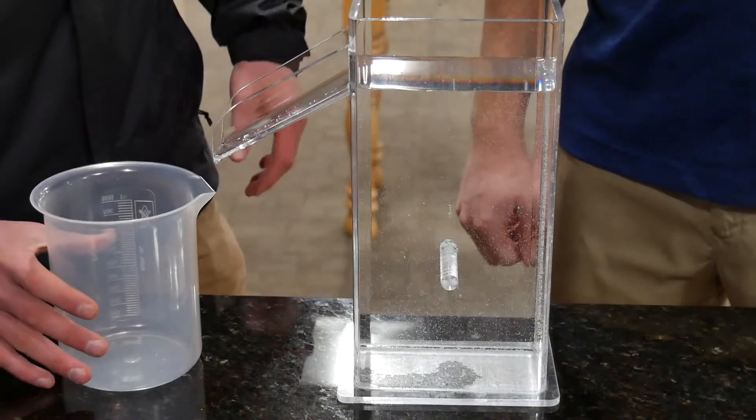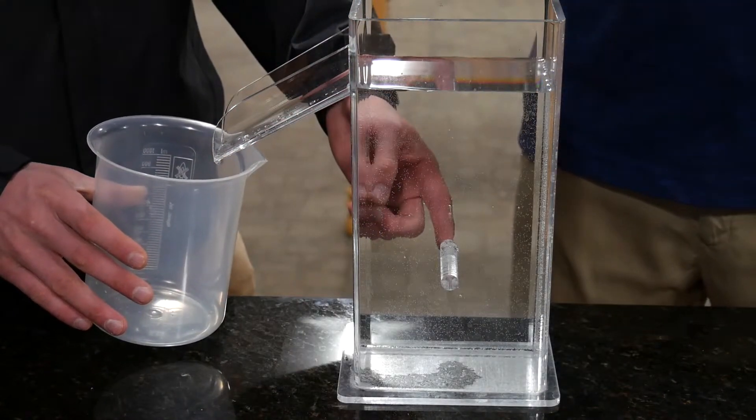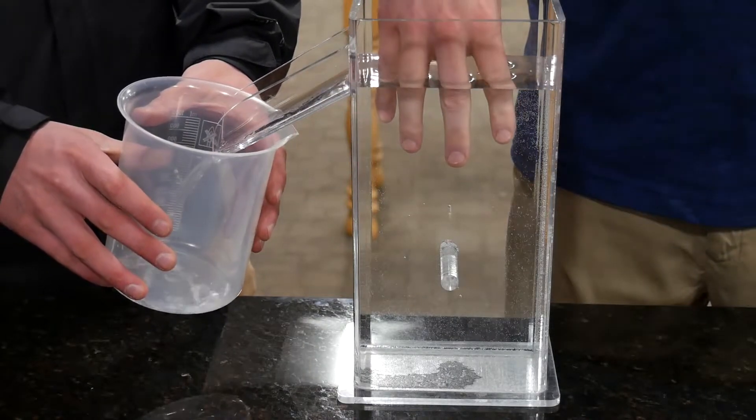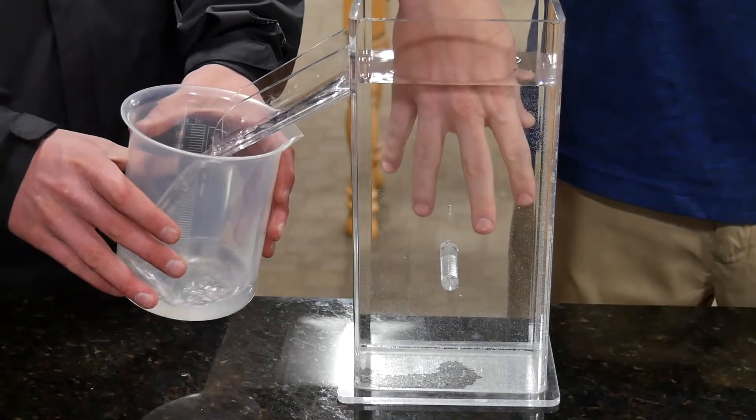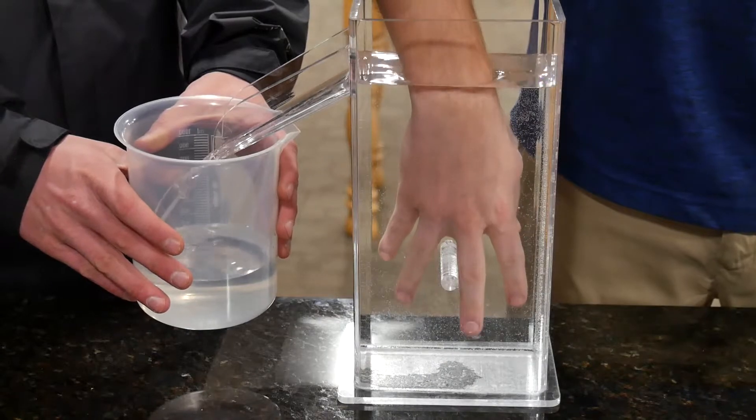Okay Parker, so let's go ahead and take your hand, your right hand, and slowly place it into the water until the bar rests between the web space between your middle and ring fingers. Just slowly put it in, and when your hand comes to rest on that bar, you're going to leave it very still until all the water stops running out of the tank.